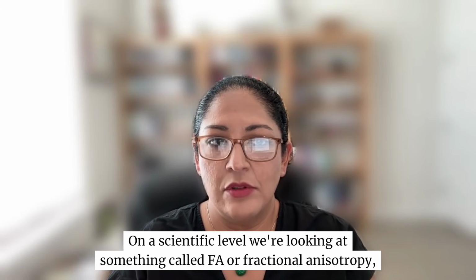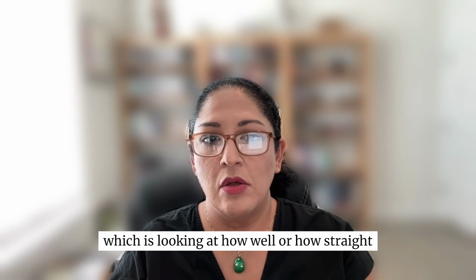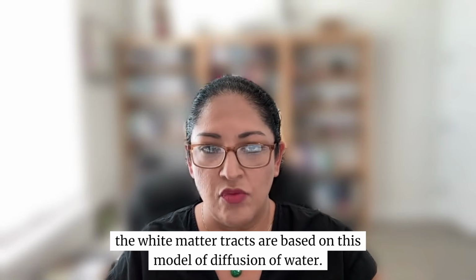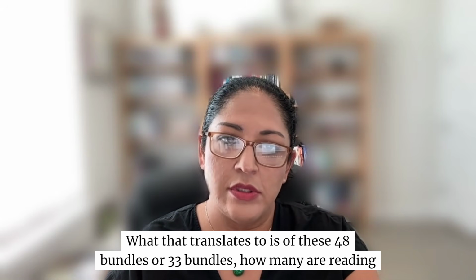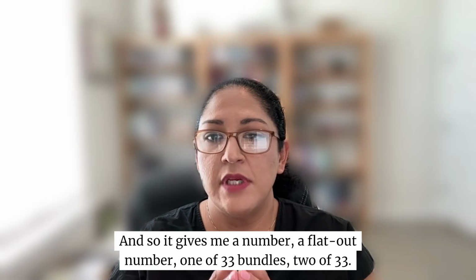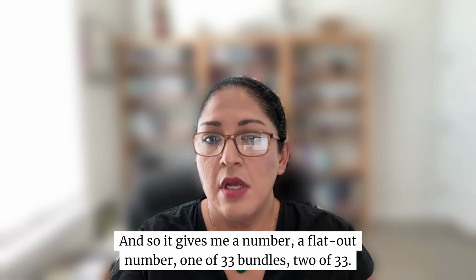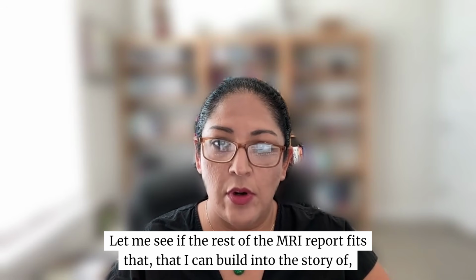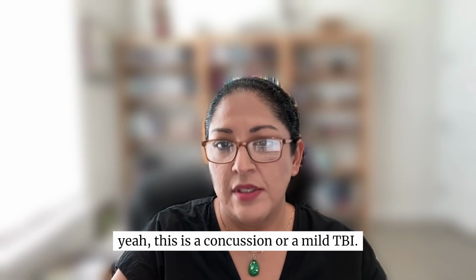On a scientific level, we're looking at something called FA, or fractional anisotropy, which is looking at how well or how straight the white matter tracts are based on this model of diffusion of water. What that translates to is, of these 48 bundles or 33 bundles, how many are reading as normal or how many are disrupted? So it gives me a flat out number, one of 33 bundles, two of 33, for me to go, okay, that's part one of three. Let me see if the rest of the MRI report fits that I could build into the story of, yeah, this is a concussion or a mild TBI.